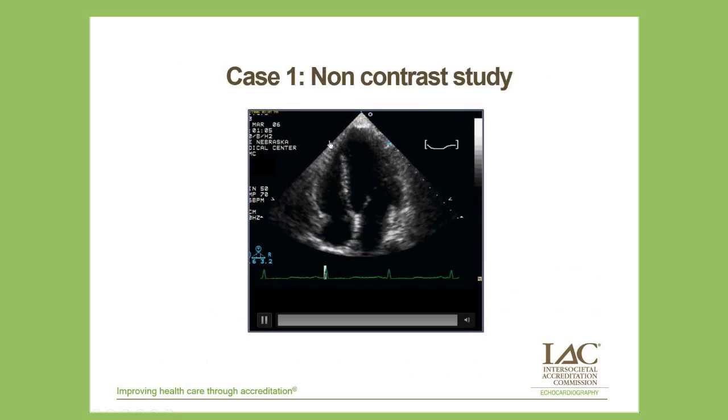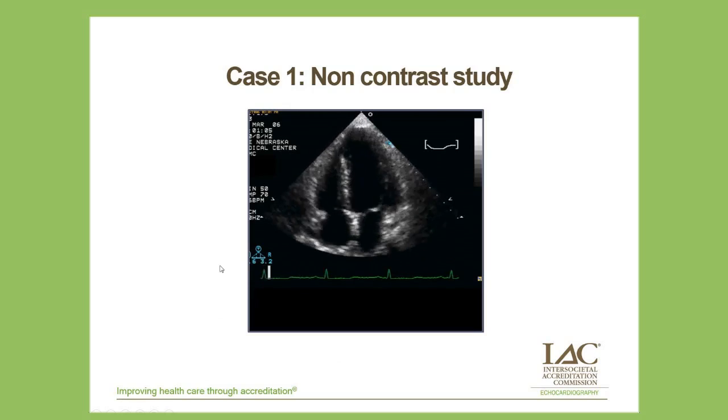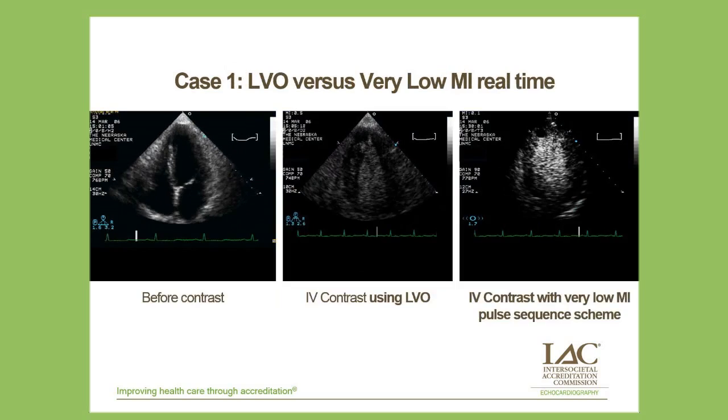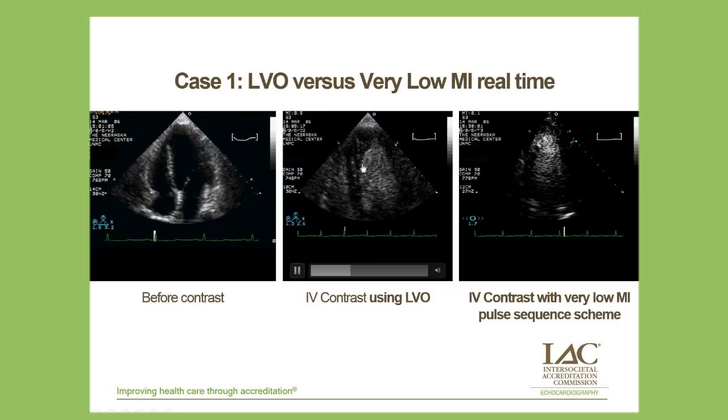And that becomes very useful in situations where we're asked to see patients at the bedside where the windows are difficult, even with high mechanical index tissue harmonic imaging here, like this patient that was just admitted for atrial fibrillation, was spontaneously converted. They wanted a rapid echo because of the question whether she had some embolic phenomena occur. So contrast was utilized to look better at this apex.